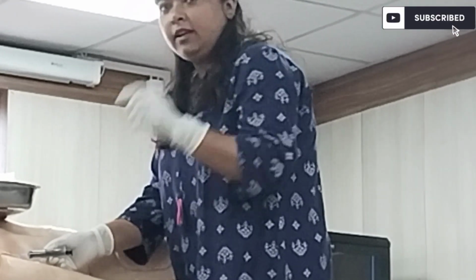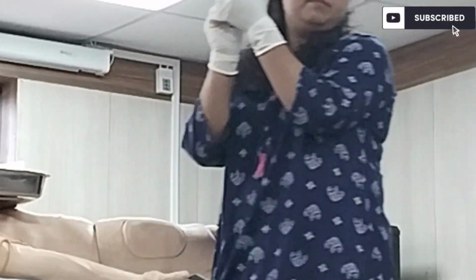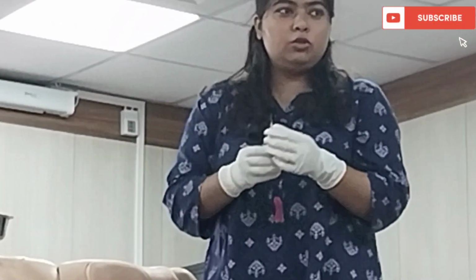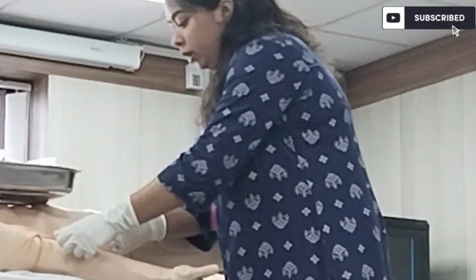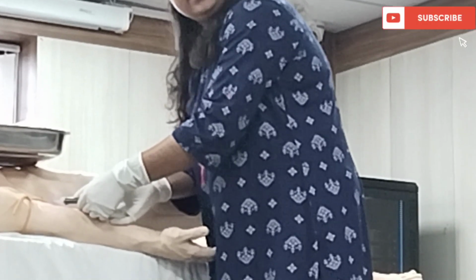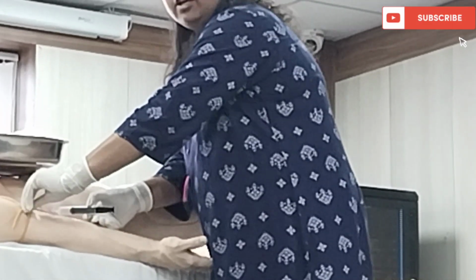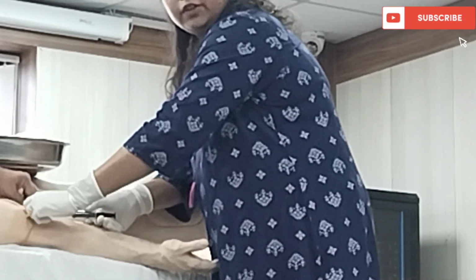If you are reaching the vein, then a blood drop will come into this hub. So you know you are in the vein. When this drop comes, you will provide some negative suction and easily the blood will be drawn inside. Have a piece of cotton ready in your hands. After the blood is drawn, you will take out the tourniquet with one hand, because I have not tied it that hard.